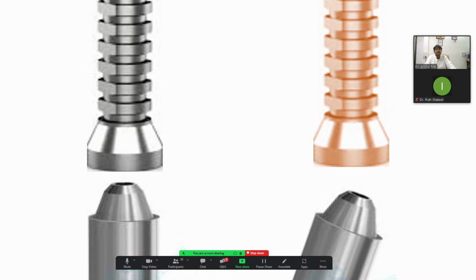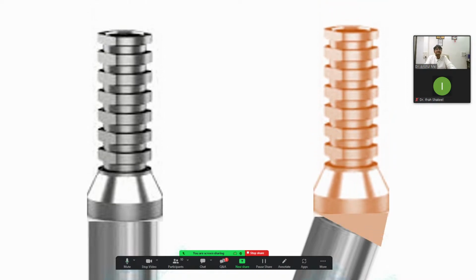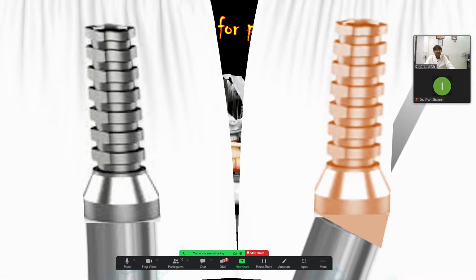So what Pathfinder is doing is giving you a common path of insertion. Now you can see everything is resting, okay, and the path of insertion is here. So it will transfer all the forces to the implant body and avoid fracturing of the screw. Okay, so that's how we place the implant. So in this we use a Pathfinder.